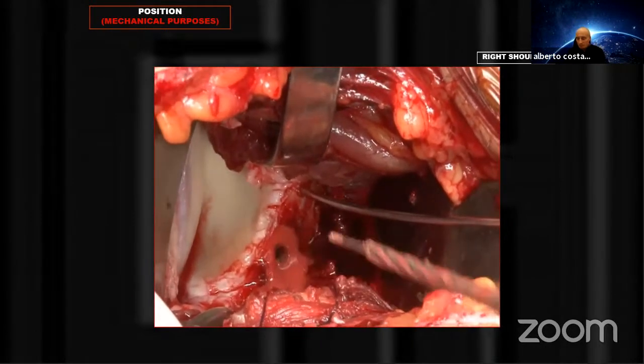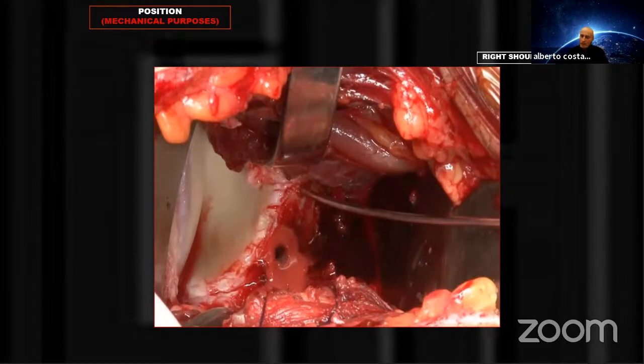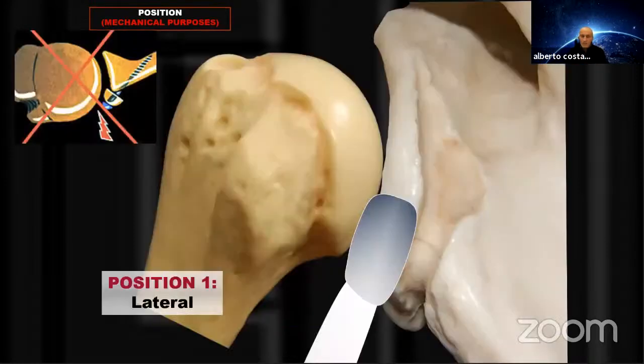And we drill, and we have to be careful with the second cortex, because we may have the nerve just behind us.